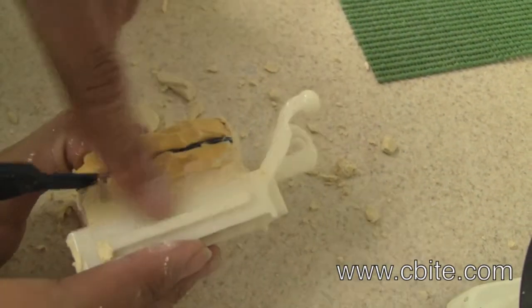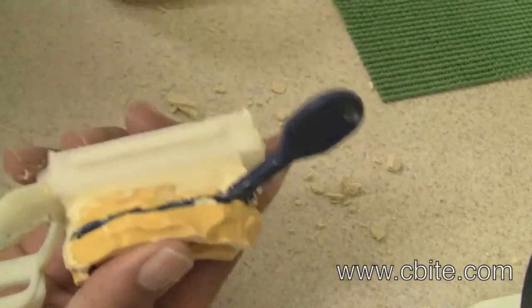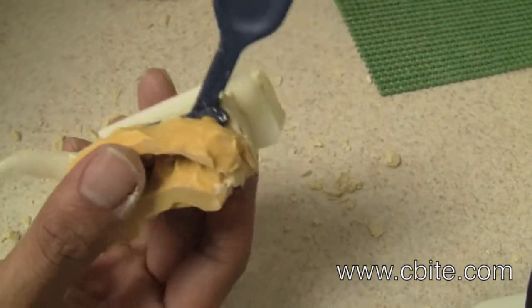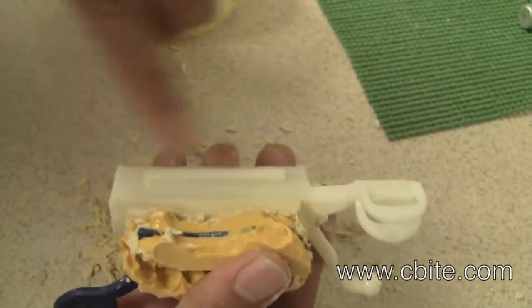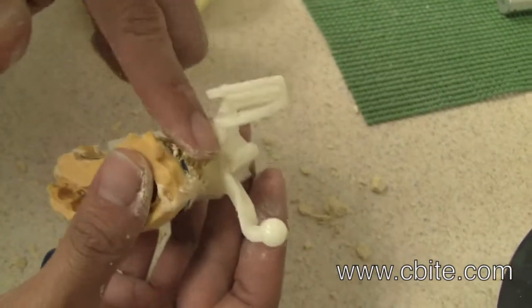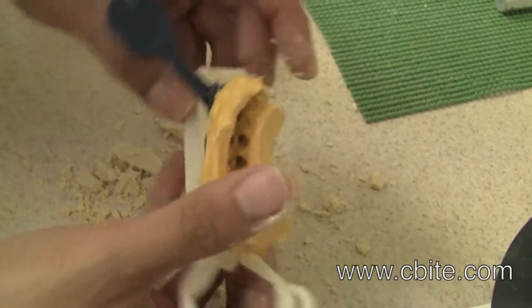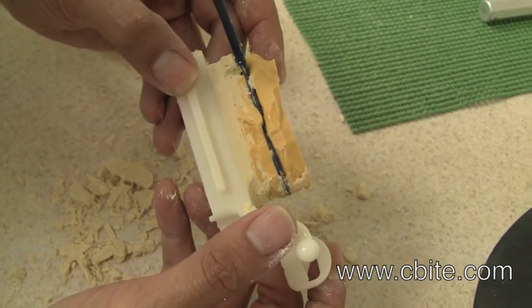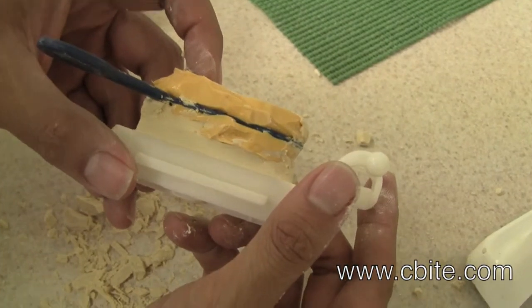Also use the wet finger technique to properly clean around the edges so the stone is flush with the edge. Now you have a properly mounted impression.